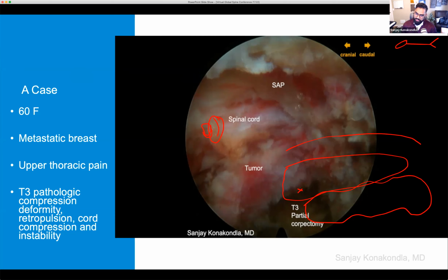I think especially with the applications of spinal oncology, as we all know, this is probably not to the point where this is going to be standard of care anytime soon. There's going to be a lot of developments here, but I think it's an interesting application if you want to avoid sneaking around the spinal cord from the dorsal approach, and really getting some work done with some good visualization.